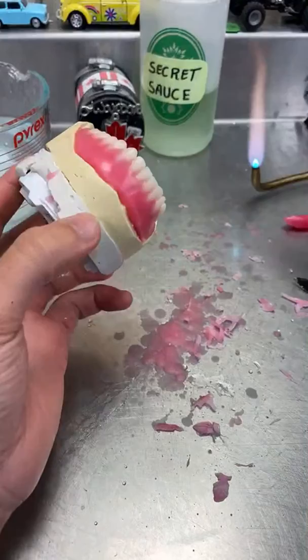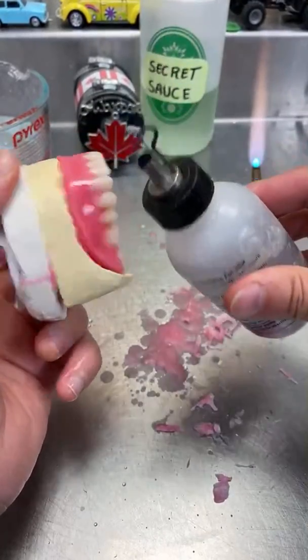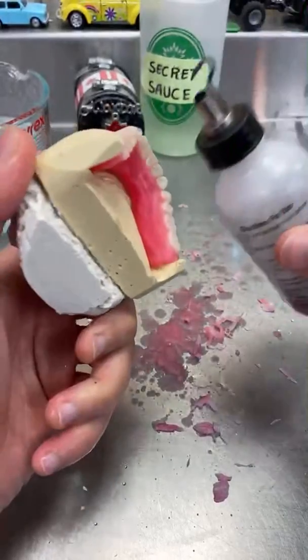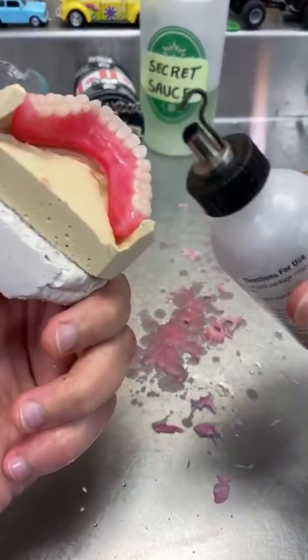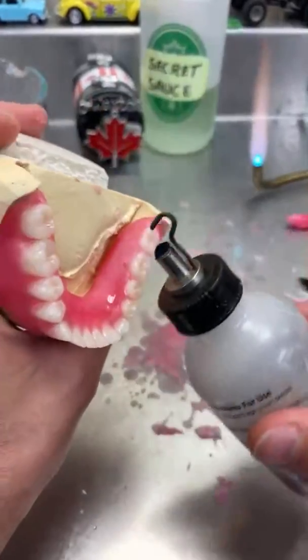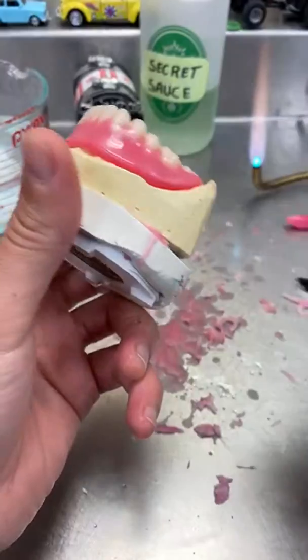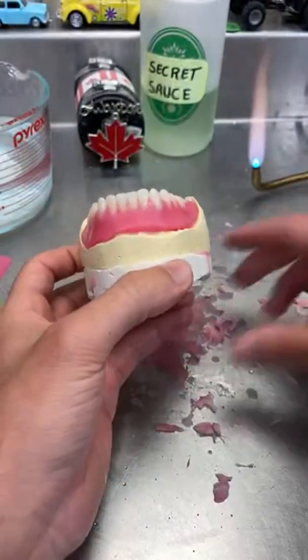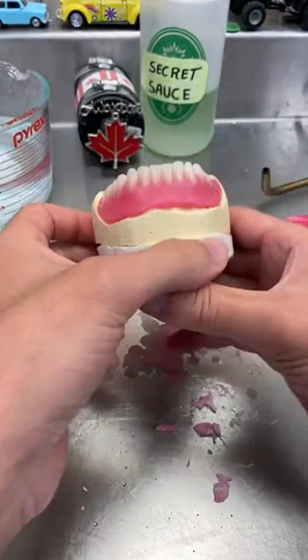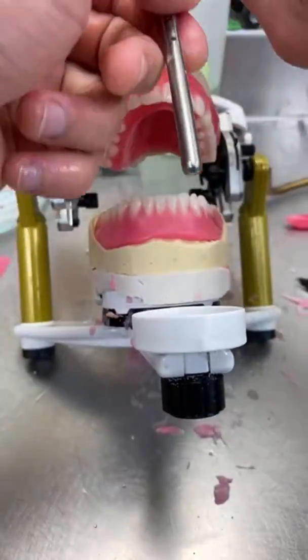Okay, so this is almost done. Oh, let me check the occlusion here, or if there's any balance left.